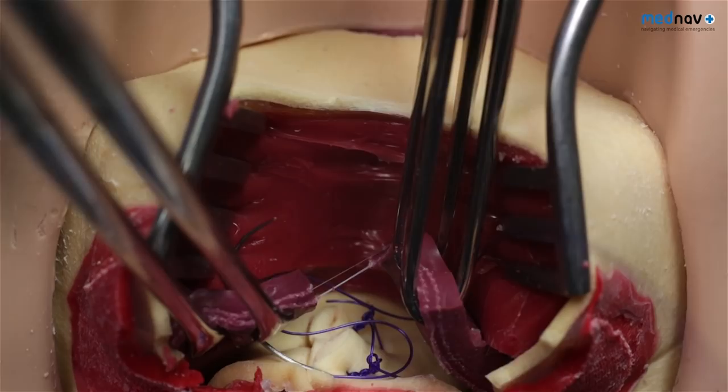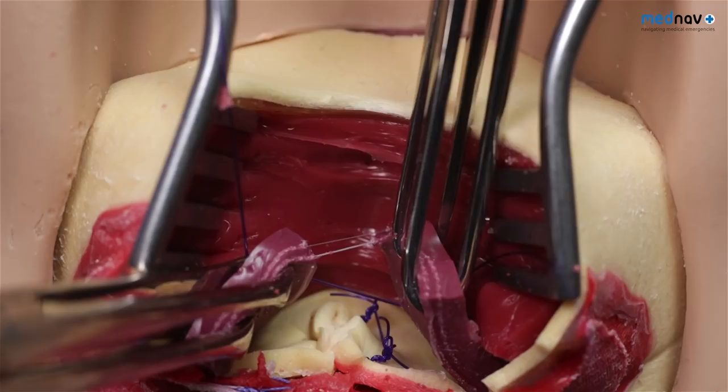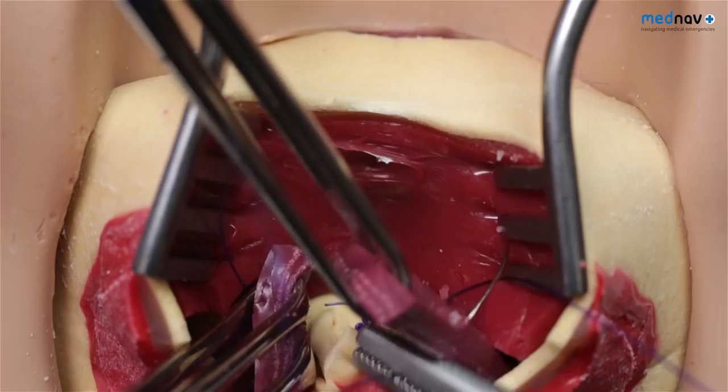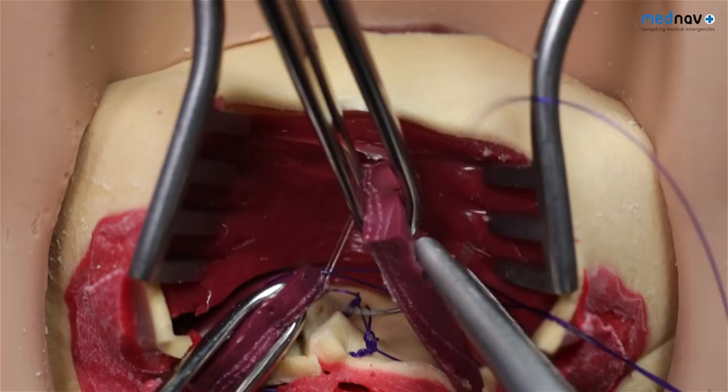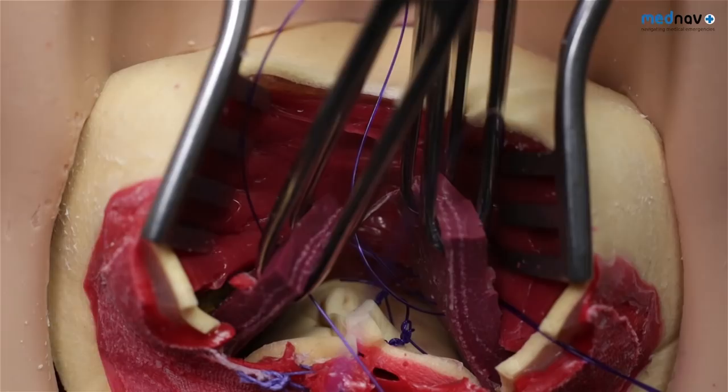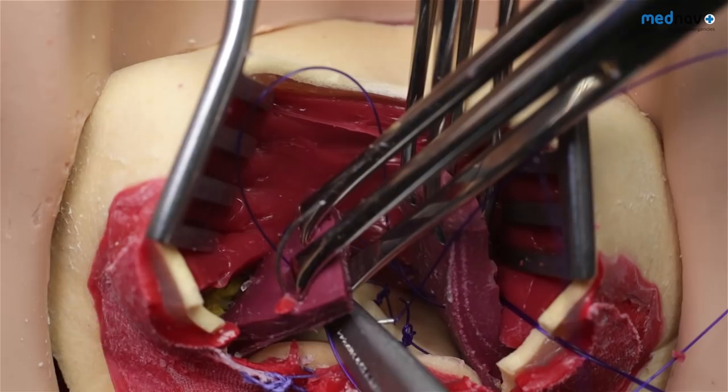Take a full thickness bite of the sphincter. Repair the sphincter in a double-breasted fashion. When you've placed your stitches, secure them with a small clip.